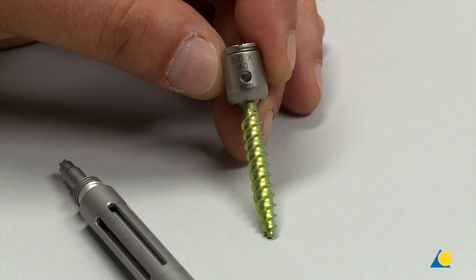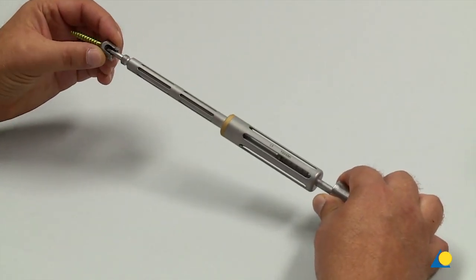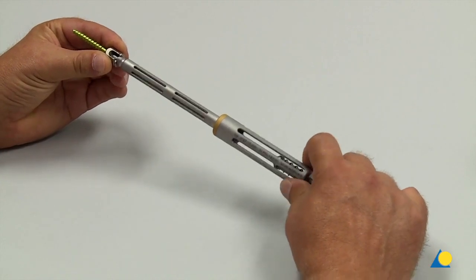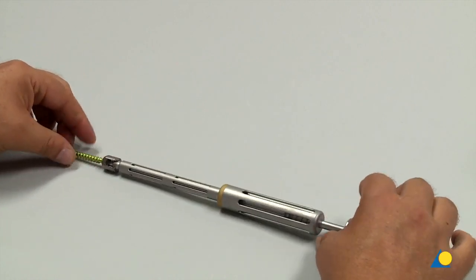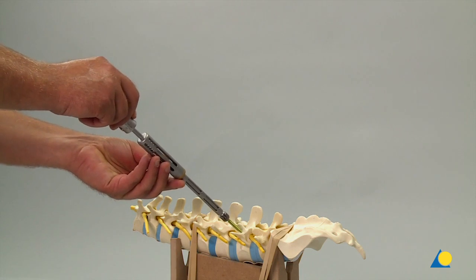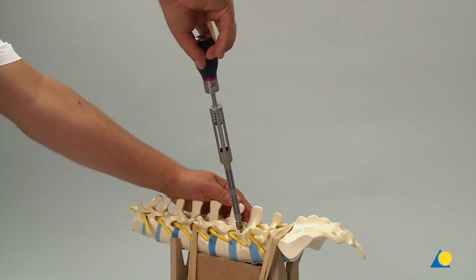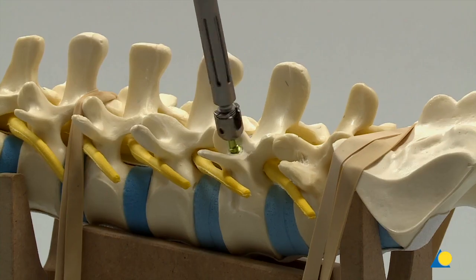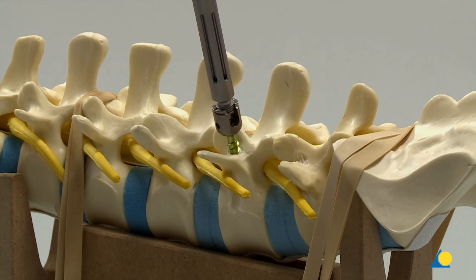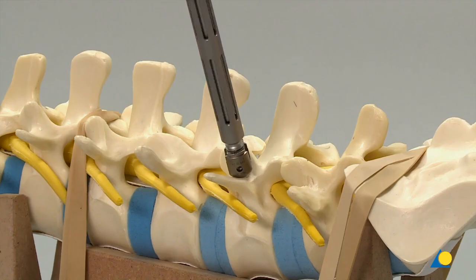The T20 driver tip is placed into the T20 feature in the screw shank. The screwdriver sleeve is slid down and threaded into the head of the screw. The screw is inserted. Take care not to over-tighten the screws, as over-tightening can result in the loss of polyaxiality and by stripping the thread can reduce screw purchase. The screw height is adjusted by turning the assembly counter-clockwise. To disengage the screw, the screwdriver sleeve must be unthreaded.